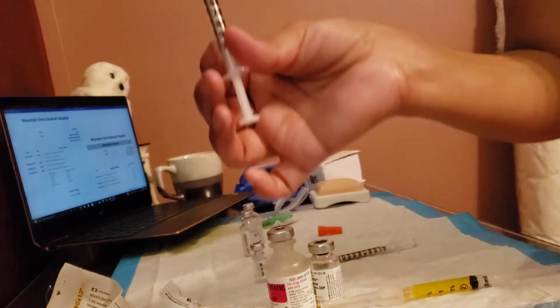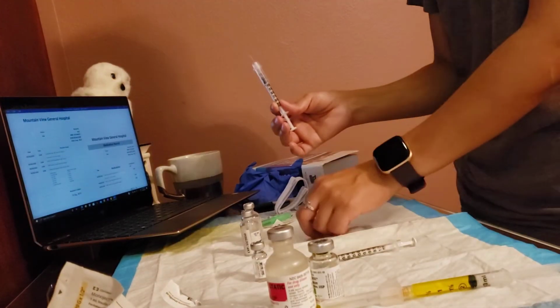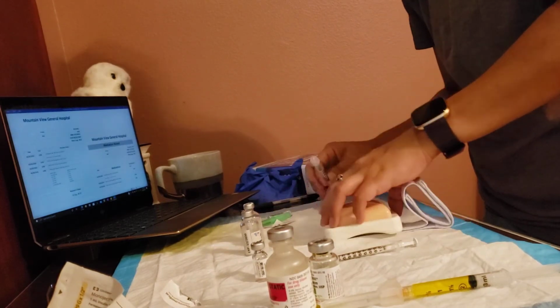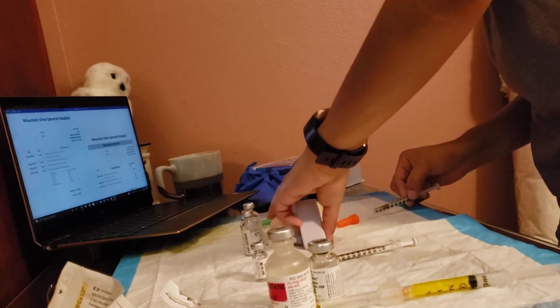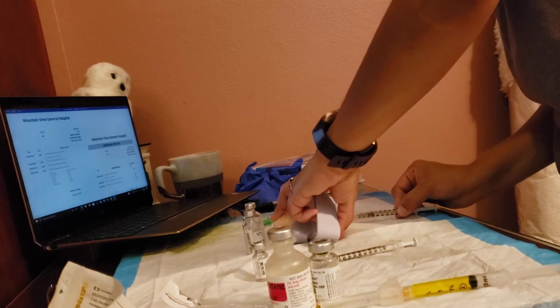And I'm going to show the camera, and I'm going to show my other nurse, and they agree with me. I drew that up good and correct. And I'm going to put my needle there.